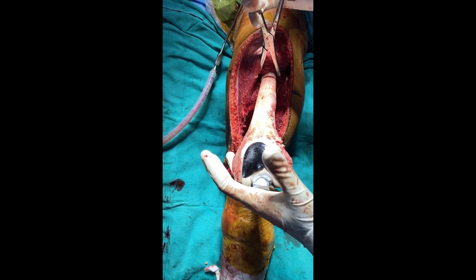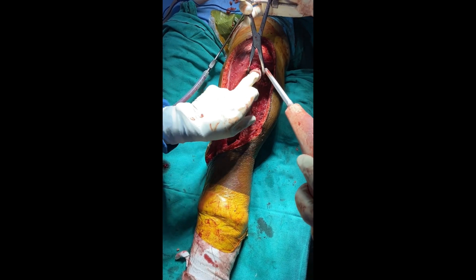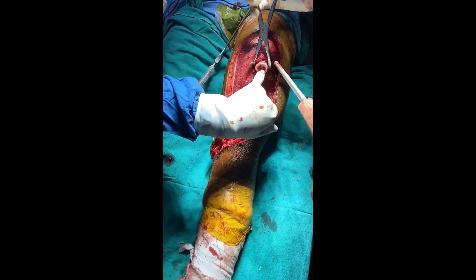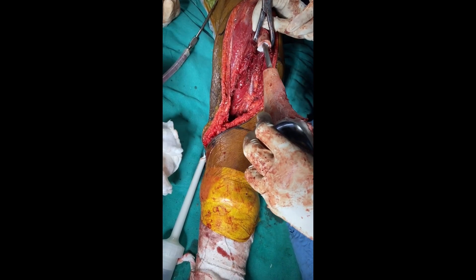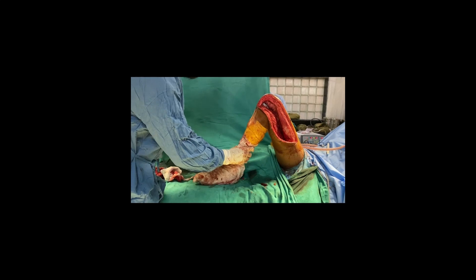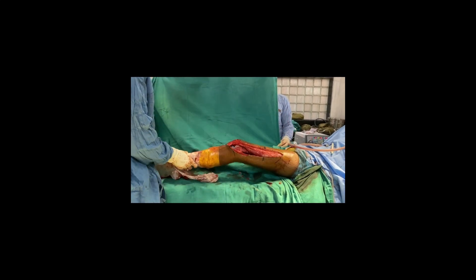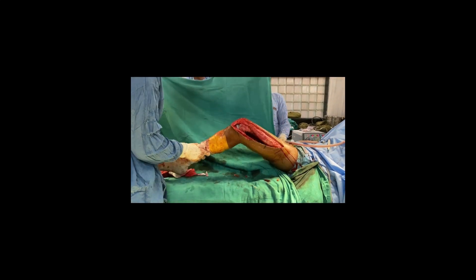Soft Tissue Repair: To complete the procedure, the surgical team carefully repairs and sutures the soft tissues surrounding the implanted prosthesis. The autograft prosthetic composite, with its advanced design and functionality, aims to restore mobility and independence to those in need, showcasing the incredible impact of medical innovation on patient care and well-being.